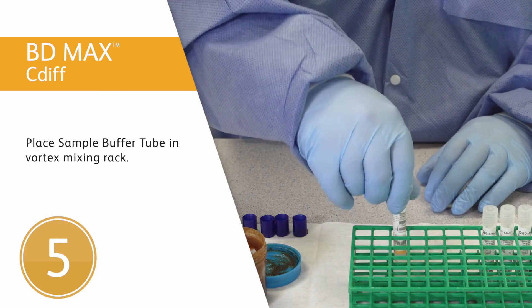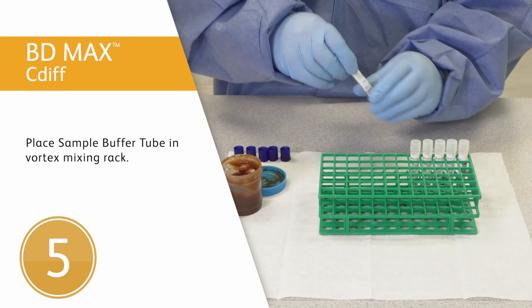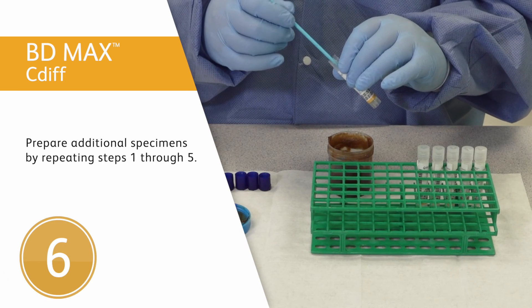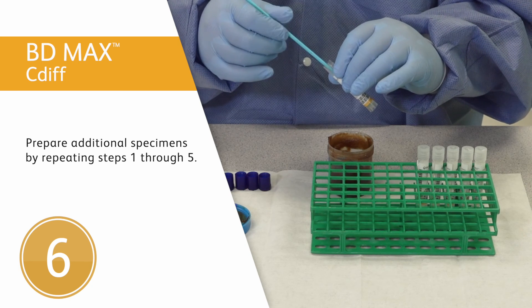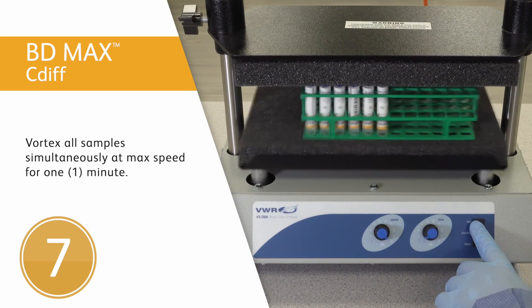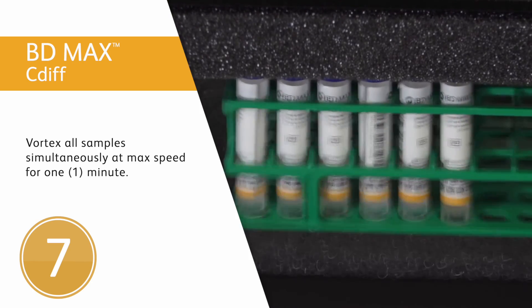Fifth step: place the sample buffer tube in a rack compatible with a multi-tube vortex mixer, for example a cryogenic vial holder or equivalent. Sixth step: prepare any additional specimens for testing by repeating steps 1 through 5. Make sure your gloves are clean before handling additional specimens. Seventh step: vortex all prepared samples simultaneously at maximum speed for 1 minute with the multi-tube vortex mixer.